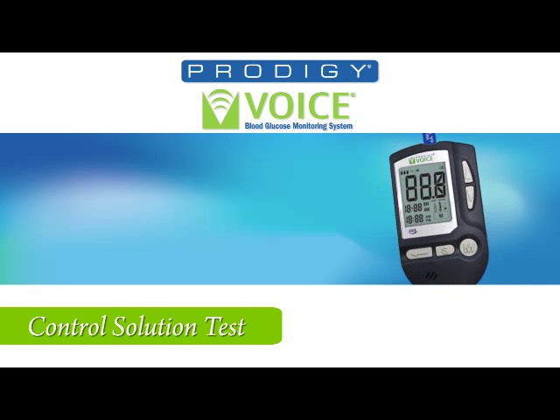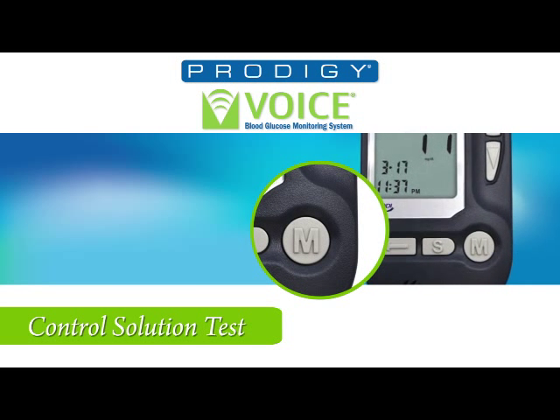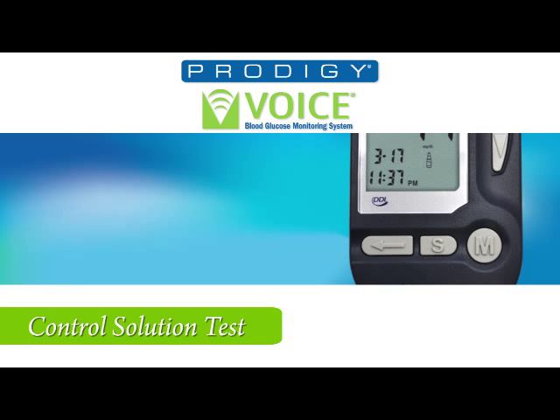You will hear: 'Thank you for using Prodigy Voice. Today's date, March 17, 2011. The time, 11:30 PM. Please apply blood to the test strip.' Hearing this, press the M button and the control solution mode will be entered. You will hear: 'You are now in control solution mode.'